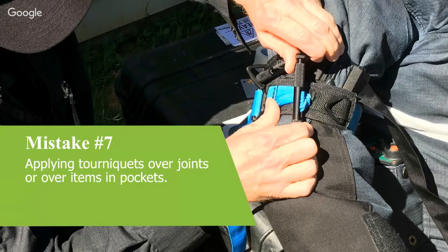The seventh generation CAT, as you said, Dan, is still a phenomenal tourniquet, and one we certainly still recommend. Those 7th gen windlasses are significantly beefier than the 6th generation tourniquets. I think there's a photo coming up later that'll show the change they've made. Yeah, absolutely.